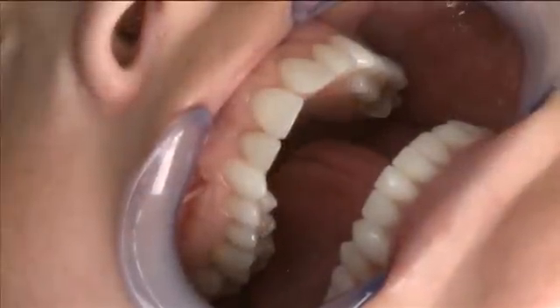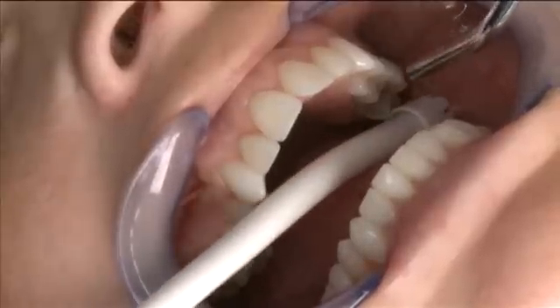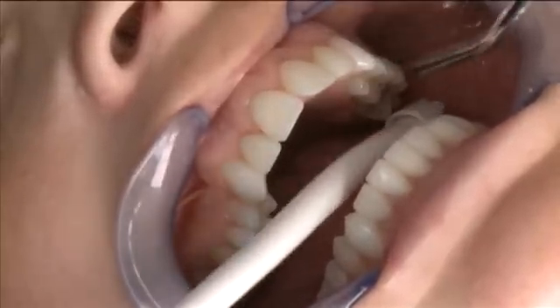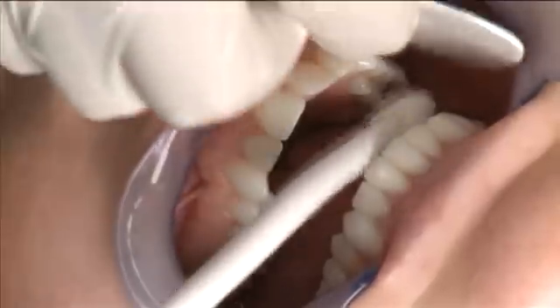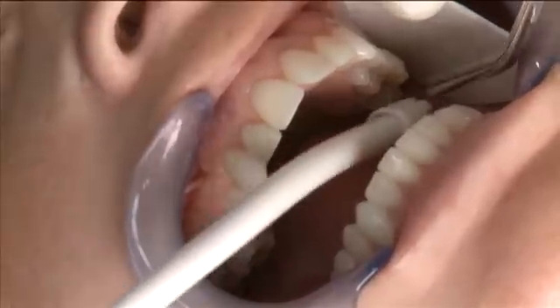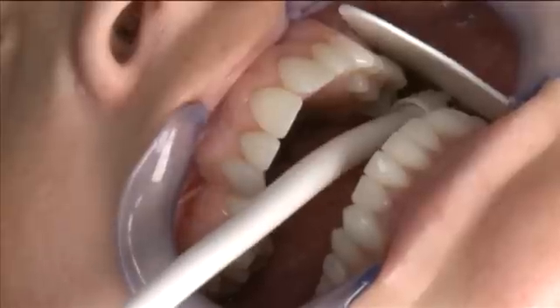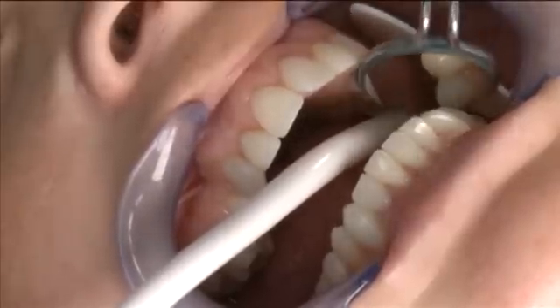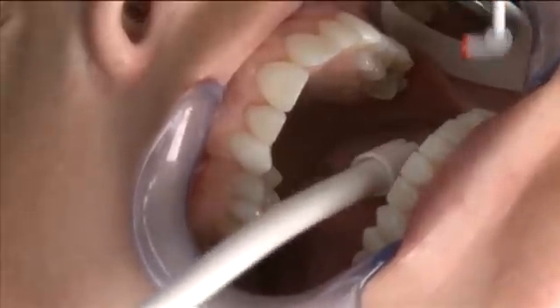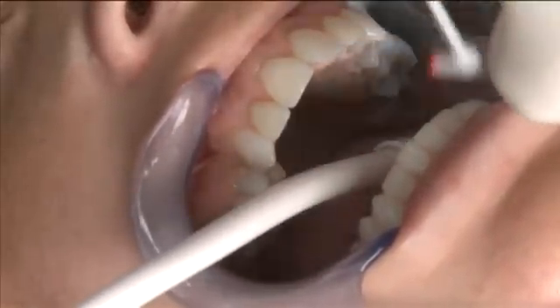Now we're going to take a full arch digital impression starting on the left side. The process begins with drying off the quadrant all the way past the midline, followed by placement of a dry angle in order to better isolate the area. Next we're going to place a light coat of OptiSpray, starting on the distal buccal at about a 45 degree angle and moving toward the mesial as we spray, all the way across the midline.